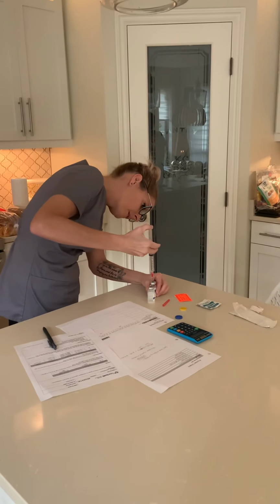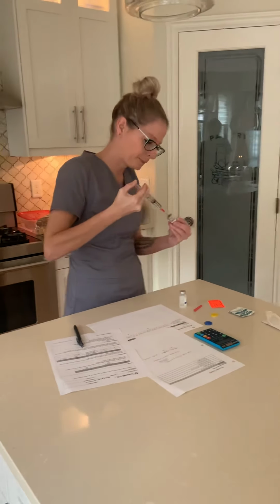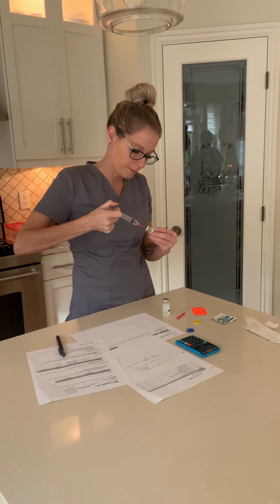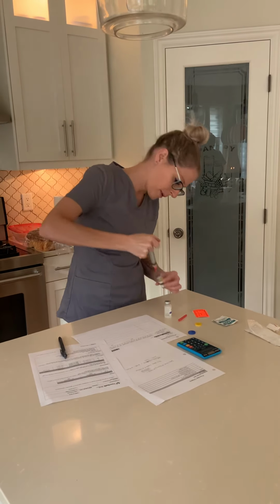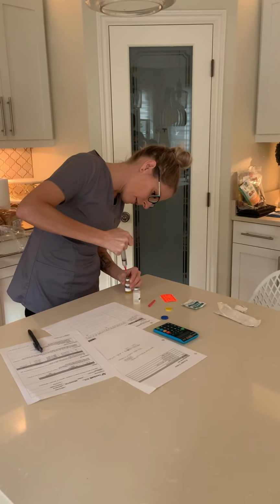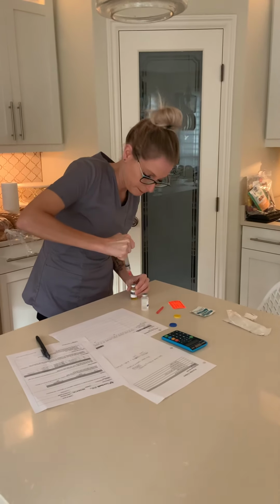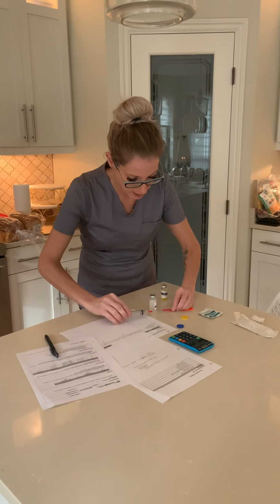There we go. Inject. So there's a lot of pressure in here right now. Make sure all the bubbles. So I'm going to draw back some air once everything is in. That's right there. Okay. So I'm just going to passively recap that.